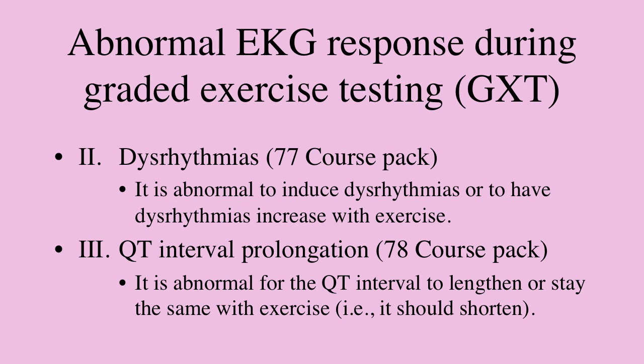This is mainly the R wave in this case. And this indicates that the heart is failing. The blood is not being pumped off like it should. The end systolic volume is increasing because it's not being pumped away. And there's exercise-induced left ventricular dysfunction, or it can also be called heart failure during exercise, if that continues to increase, like that example on page 79.